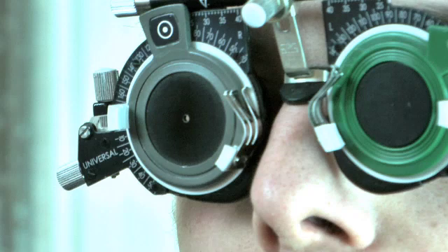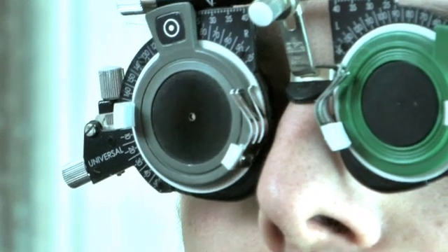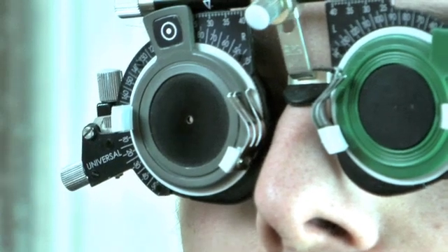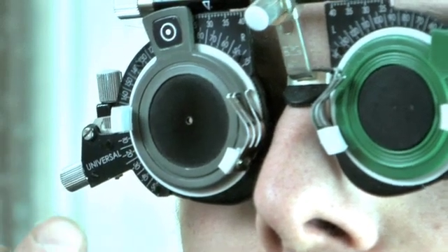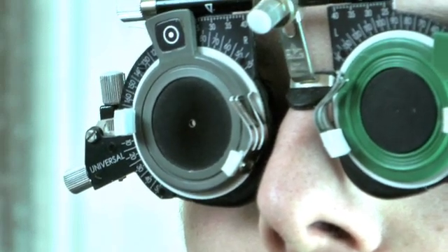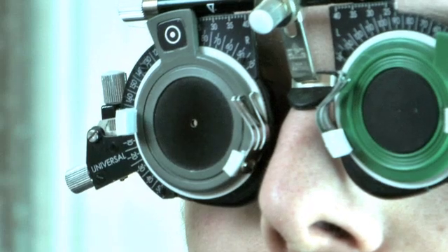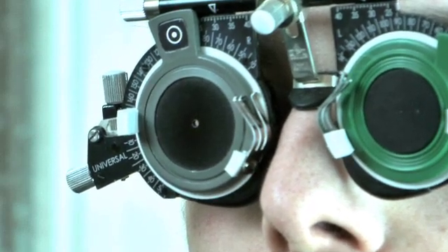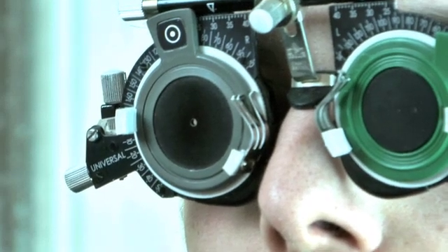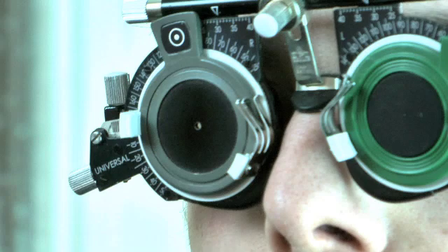If the pinhole doesn't make any improvement to his vision, then we know that this eye, the right eye, is amblyopic. It means that it cannot see very well. It may be that he has a dense cataract or some form of eye disease. But whatever it is, this eye won't be able to see with glasses.